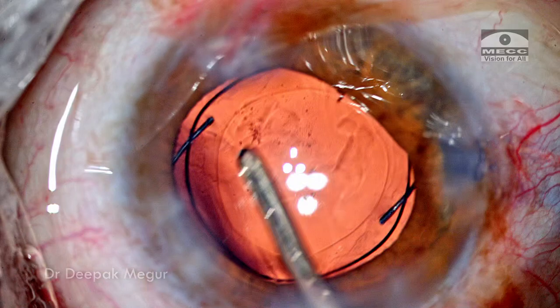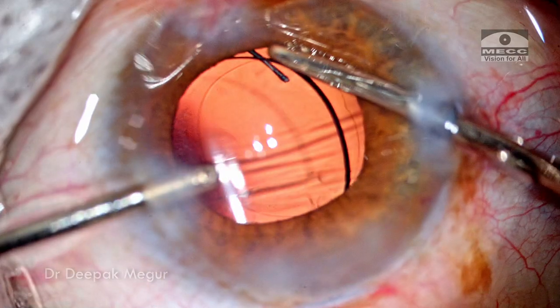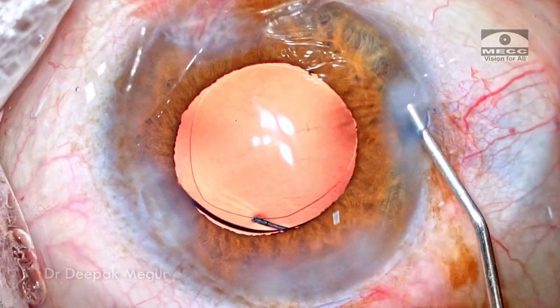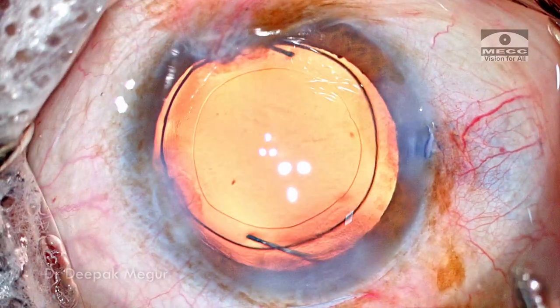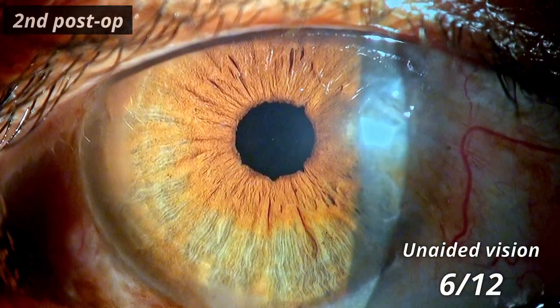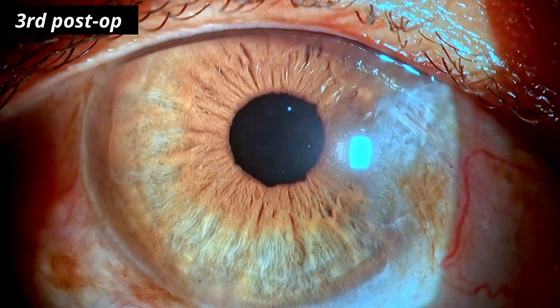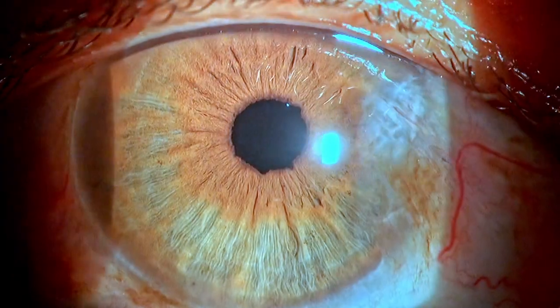Time to remove the OVD — both in front and behind the lens is being irrigated out. The side ports are hydrated. That's it, the case is done. This is the first-day post-op picture. The patient had an uncorrected visual acuity of 6/12 and she was delighted. We'll take care of the pterygium at a later date if it progresses; otherwise we're just going to leave it as is.